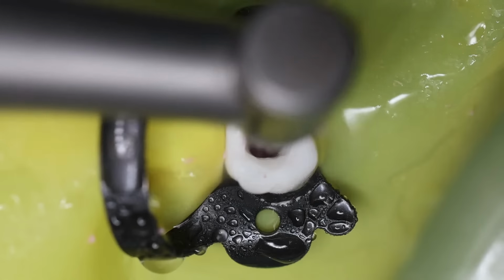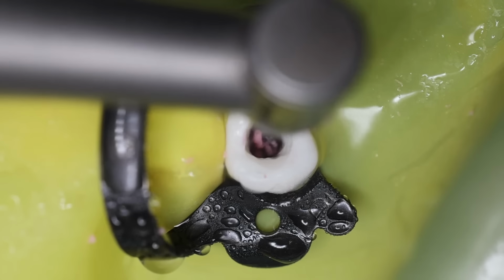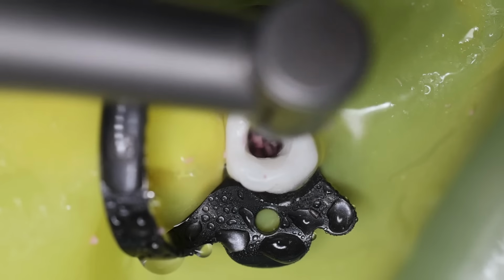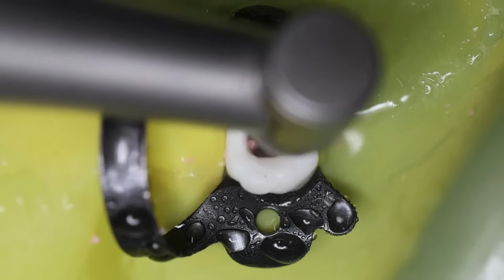We are going very slowly so that we don't harm the radicular pulp. In any case, we are not going into the orifices of the root canals.